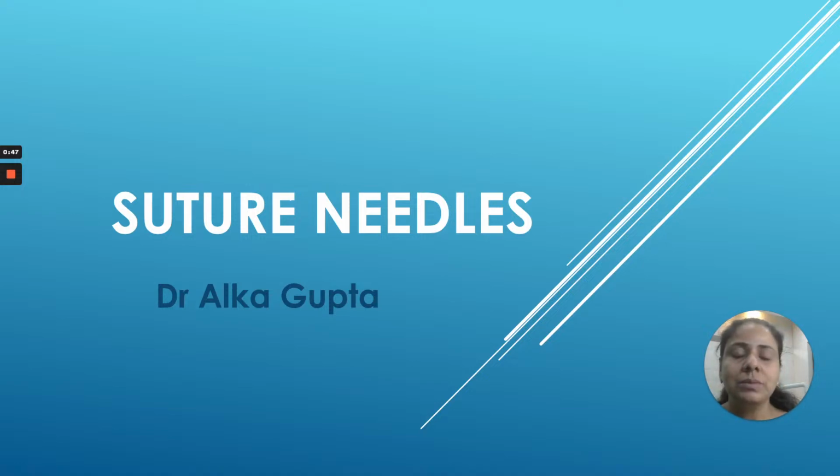Separate presentation on this, because suture needles are very important. If you are not selecting the proper needle size, needle length and the type of the needle, whether it is a round body or a reverse cutting needle, then it will be very difficult for you to actually practice suturing. And there will be problems of needle bending, needle breaking in between the sutures, and needle tearing the tissues. So you have to be very careful while selecting your needle, because the needle is the thing that is actually piercing the tissues and starting the suturing process.